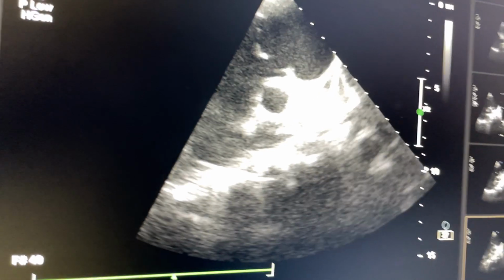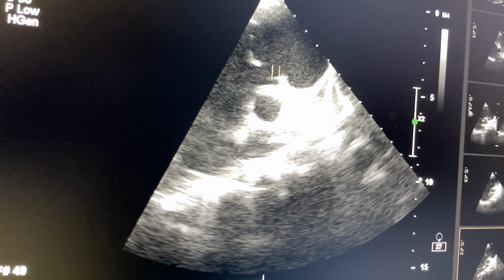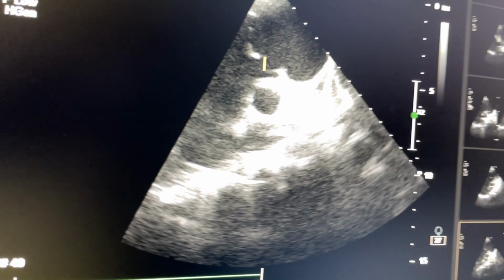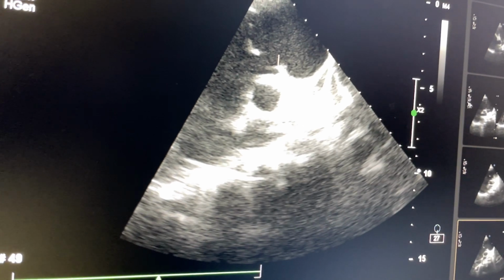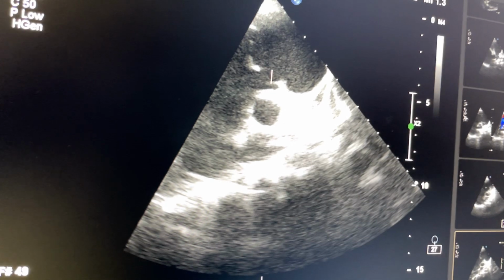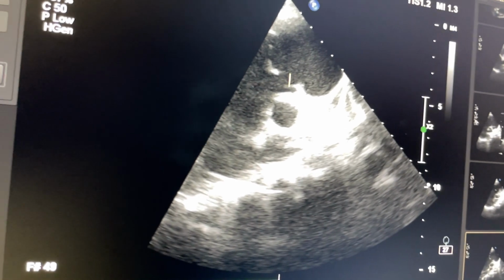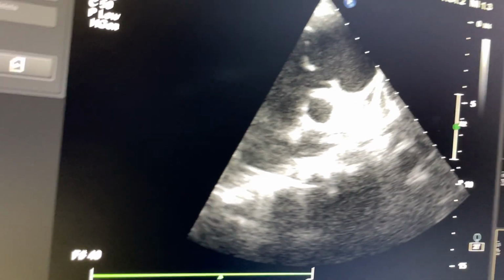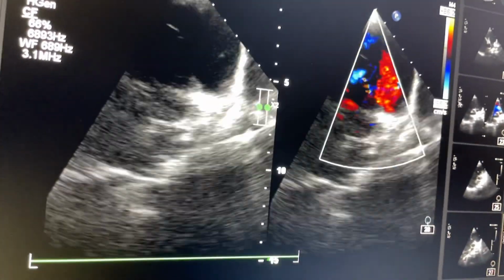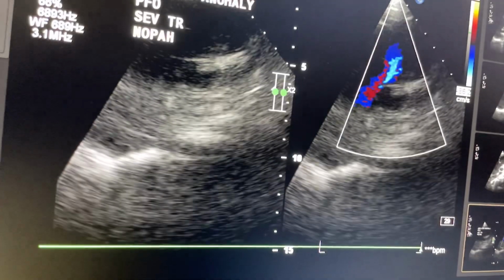You can easily see this part has this septal leaflet and the anterior leaflet is not touching each other, so there is poor coaptation, ultimately leading to severe TR. Whenever you find this Ebstein's anomaly, usually you will see the severe TR without much raised right ventricular systolic pressure. So this case has got severe TR without high right ventricular systolic pressure. You can see the TR.